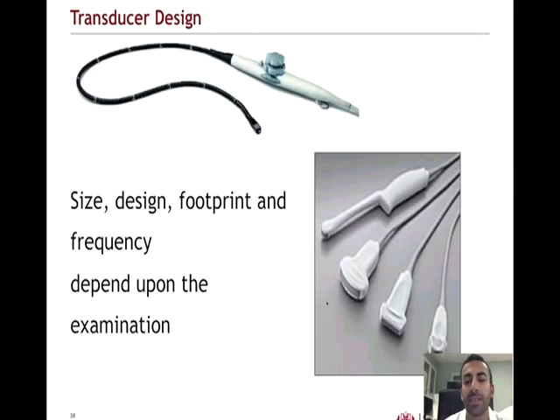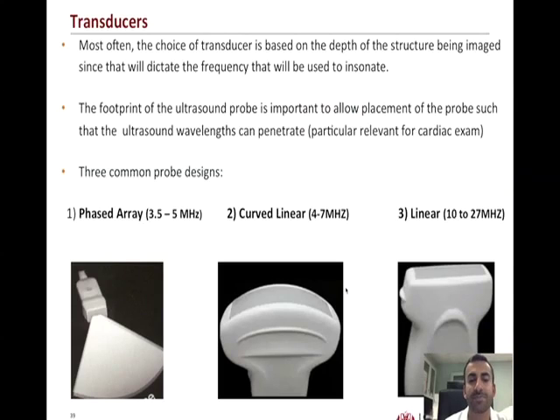And again, to go through the esophagus, you'll have a cardiac or phased array probe, you have a linear probe, and you have a curved linear abdominal probe. So these are the three probes that we'll really try to focus on, again, with the point-of-care ultrasound umbrella.